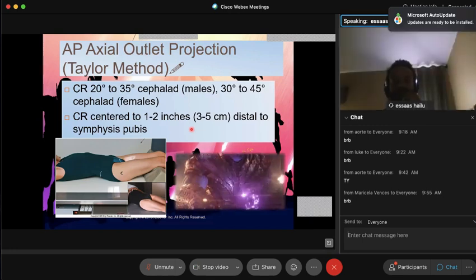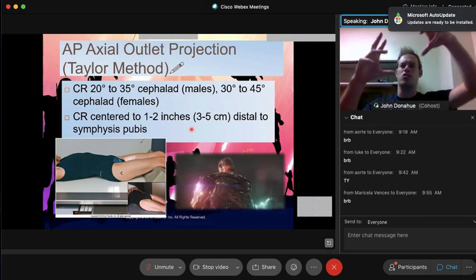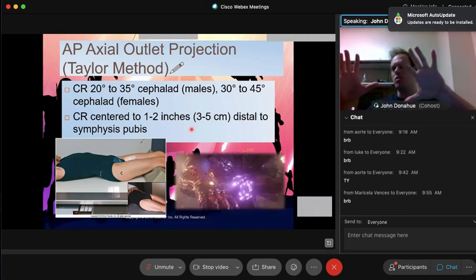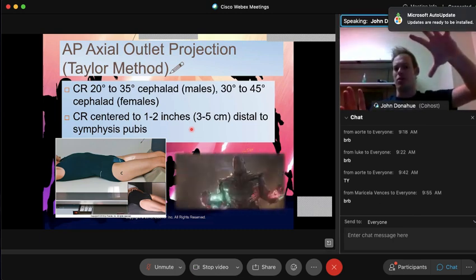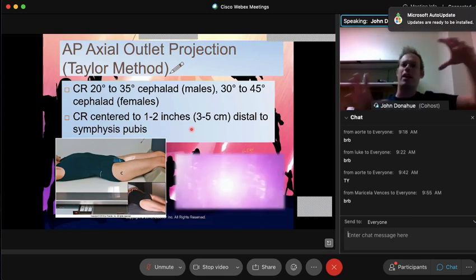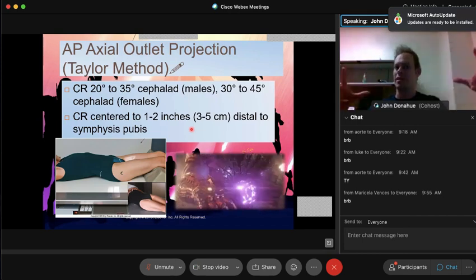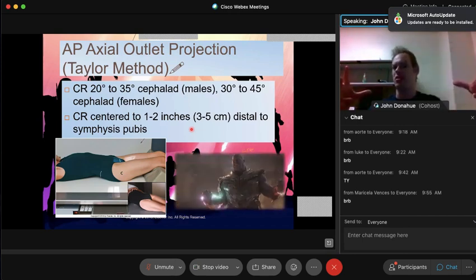Very good, Asias. Very good. Because as I add that sharp angle, what does the anatomy do? It distorts and stretches out. And look, once again, that's a very sharp angle on that tube. So it's going to really distort that pelvis. And we want to include as much of that pelvis as possible. So we're going to sit it a lot lower to accommodate that sharp angulation.